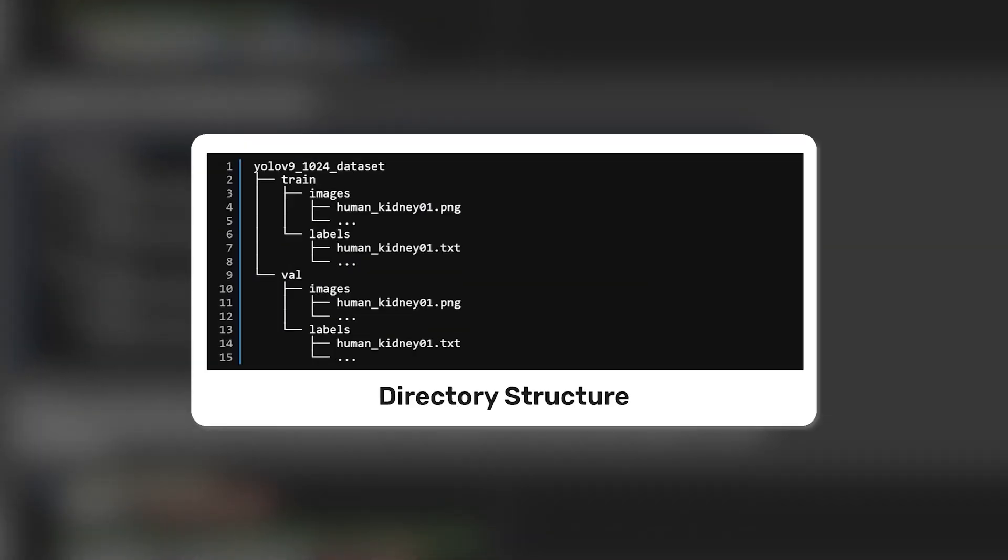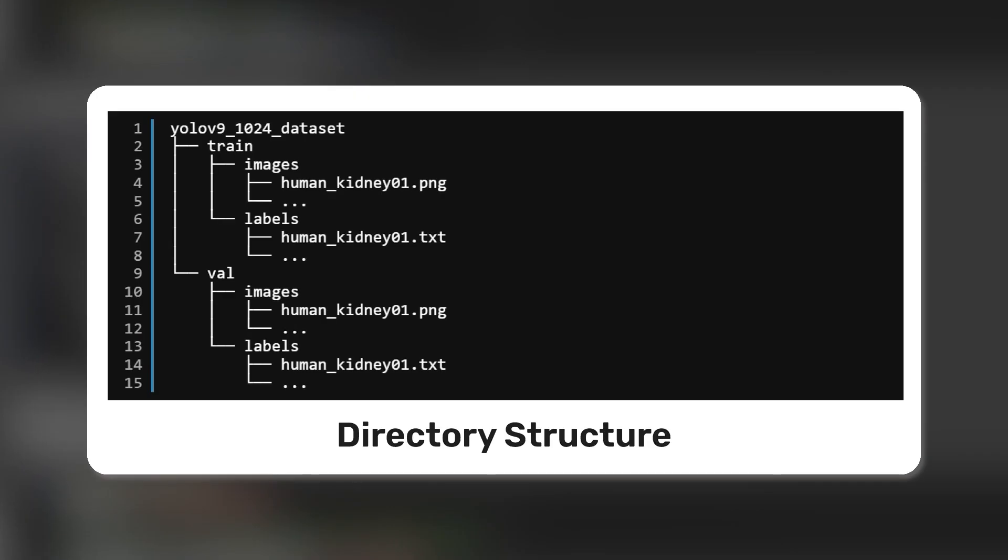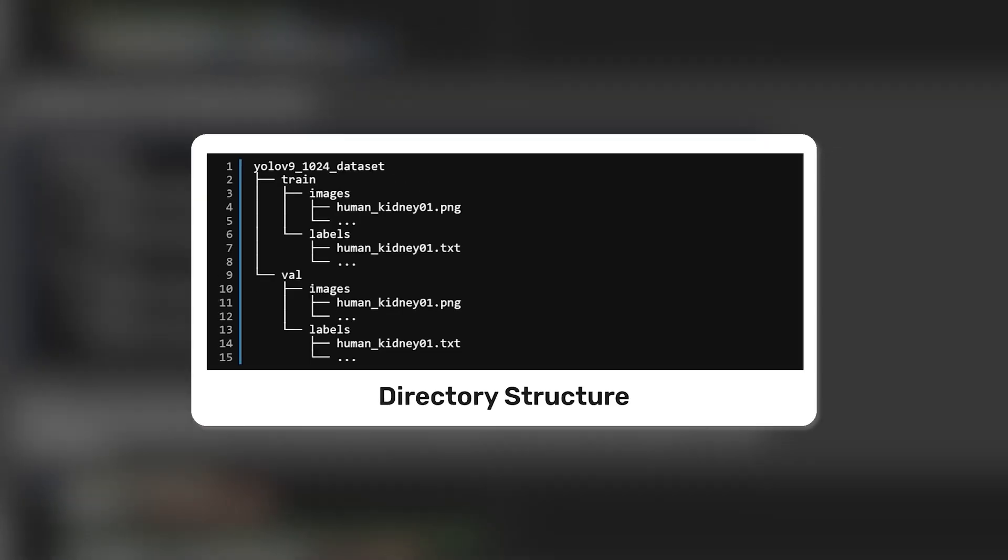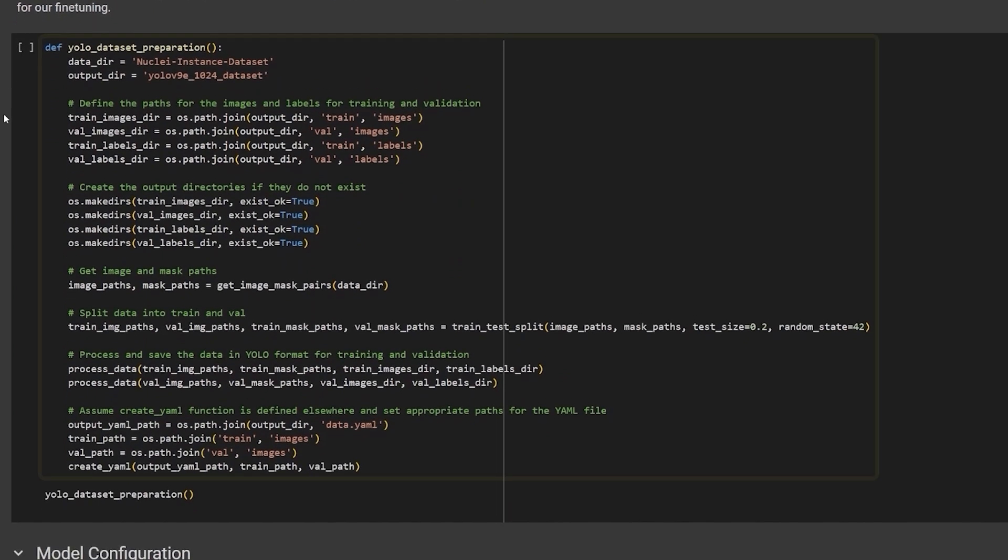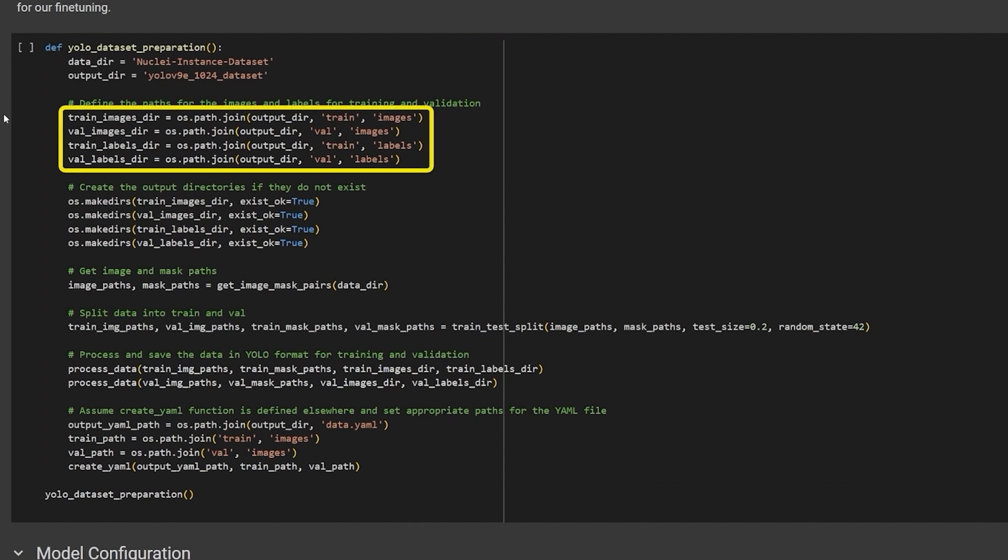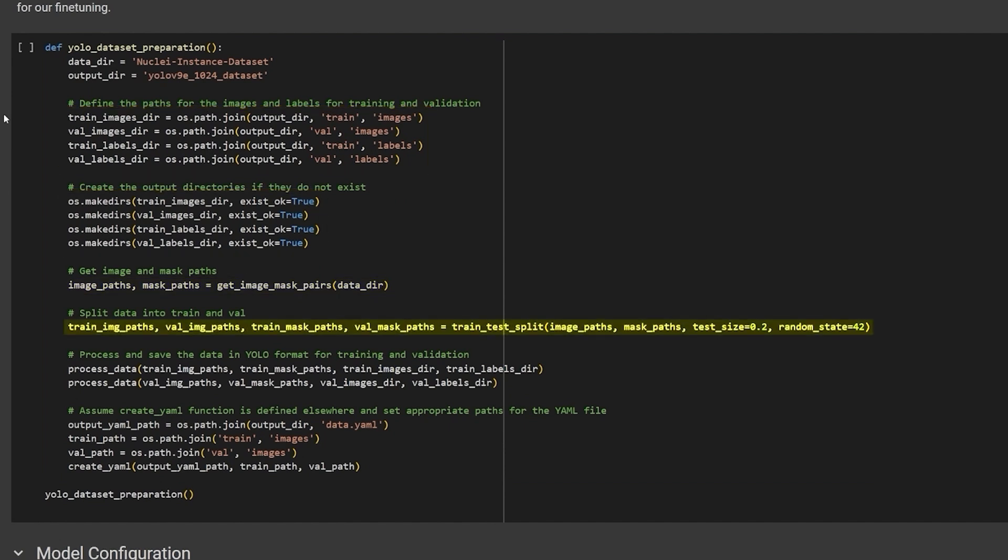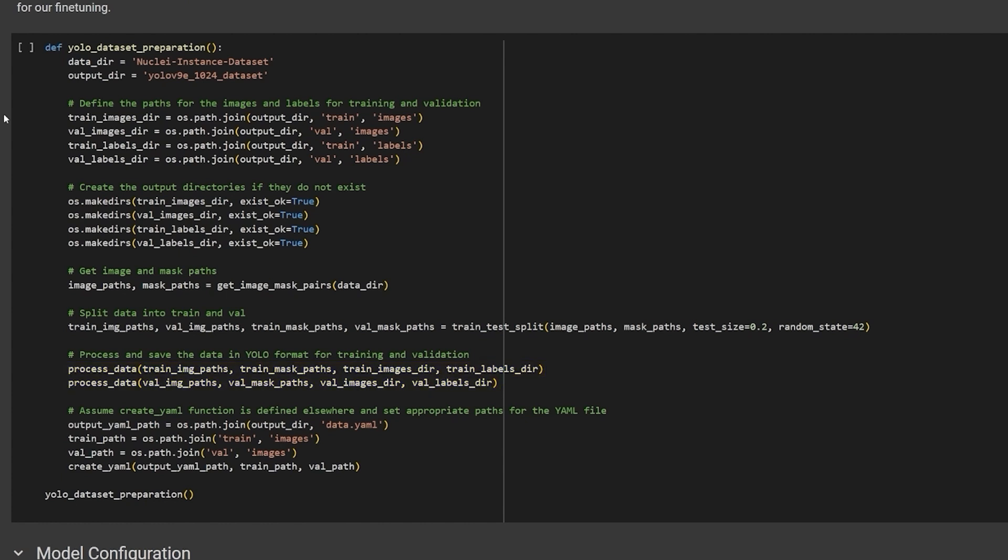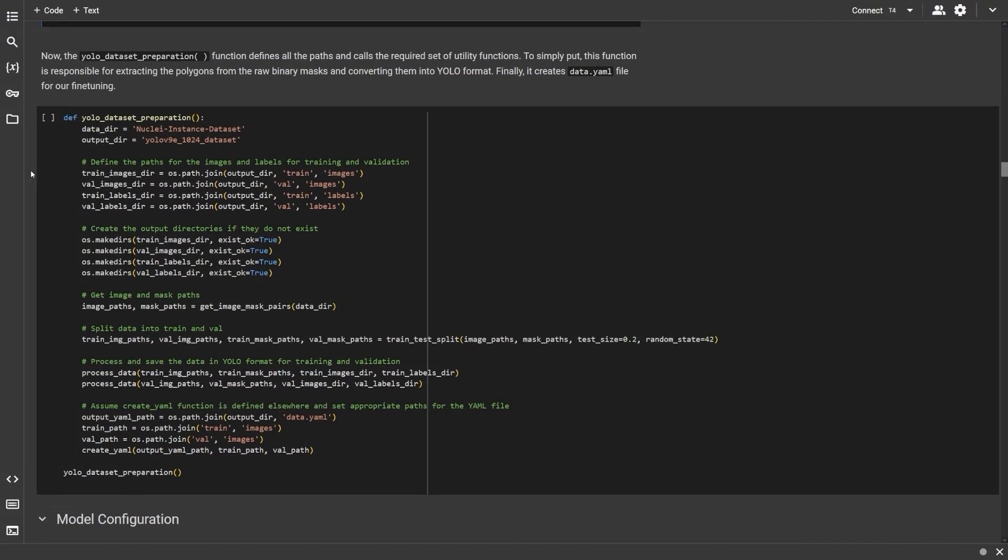The YOLO dataset preparation function is our driver function to prep the dataset. It defines all the paths, creates the directories, reads the images and splits them into train and test set. The function then calls the processData function to save the annotations in YOLO format and finally creates the YAML file.